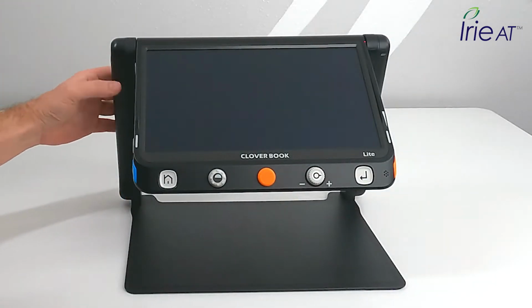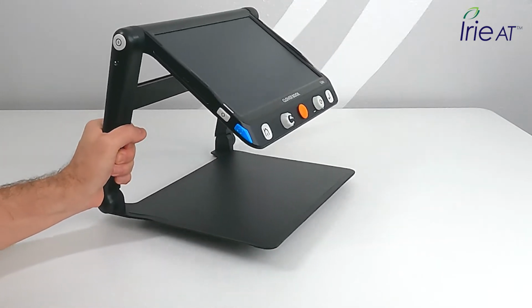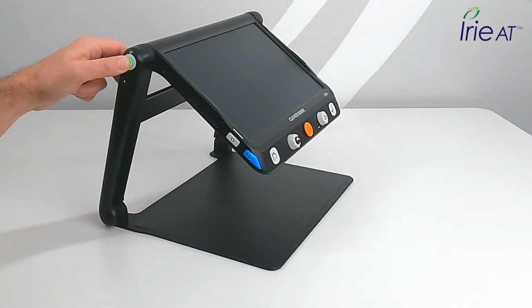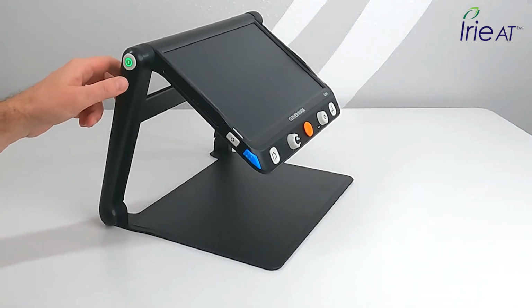All right, let's go ahead and fire this up. So to turn it on, notice I'm just moving this around with one hand. It's so nice and light. I'm just going to long press the power button on the left side of the left arm up near the top.